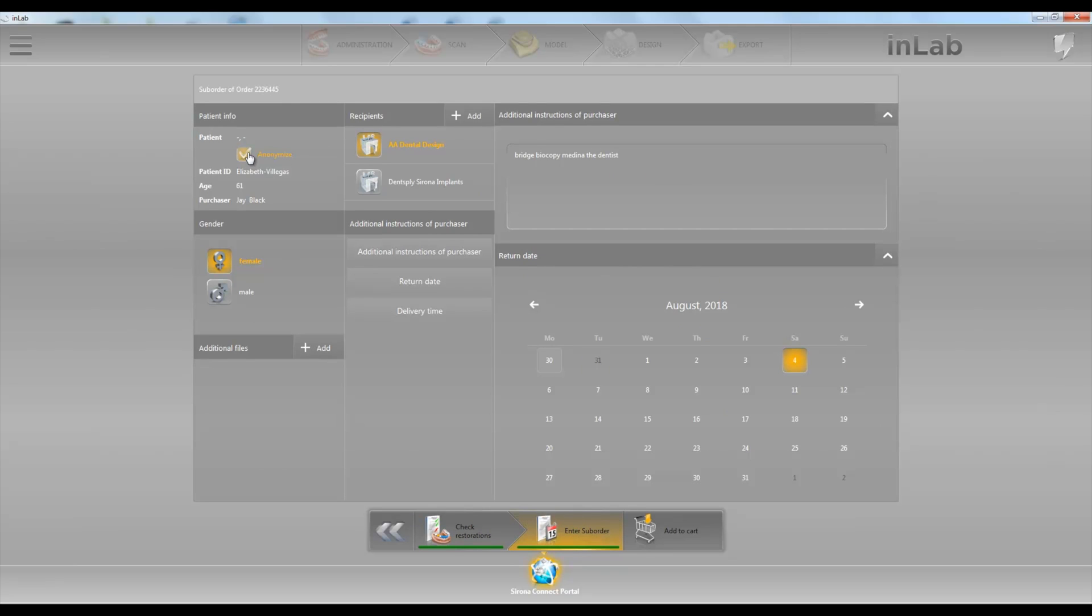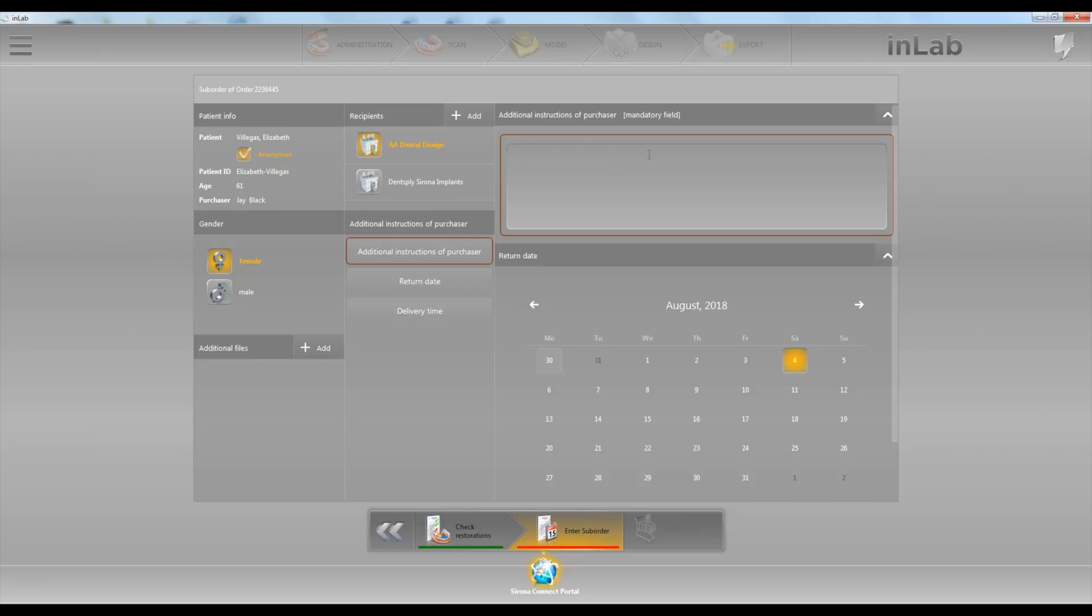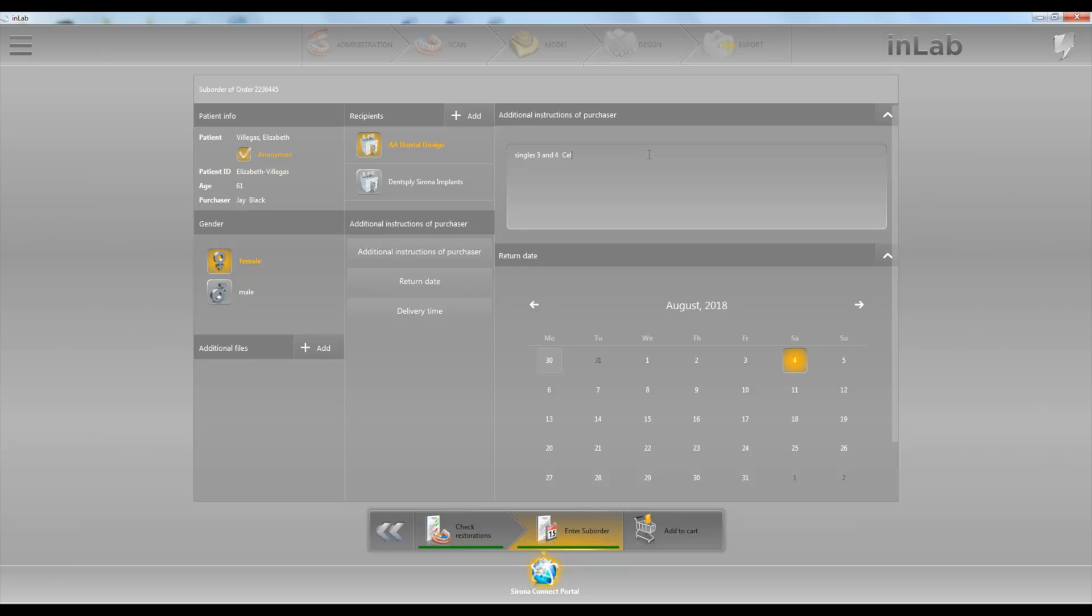So here we'll go ahead and choose a patient name or we can anonymize it. Male or female, what lab do you want to send it to. Let's say singles three and four and we want Celtra for this case.